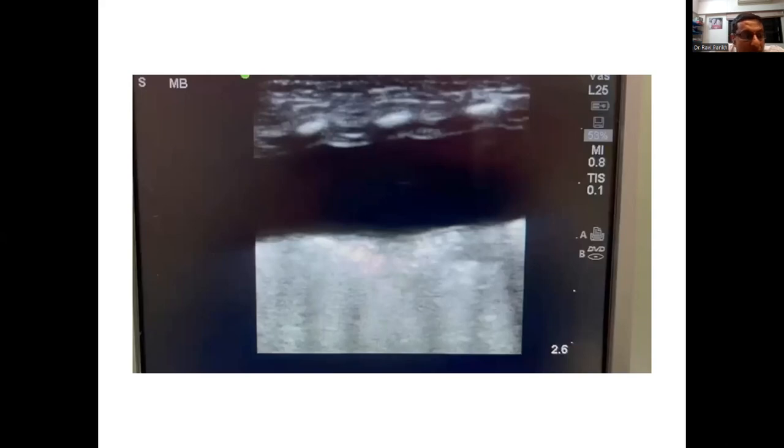Now, if you're using a cannula, again, you'll be able to see the tip of the needle, and I'll show you how to do it. But once the needle comes out, it's very difficult to then visualize anything. So, our second last talk, we'll cover all of this.